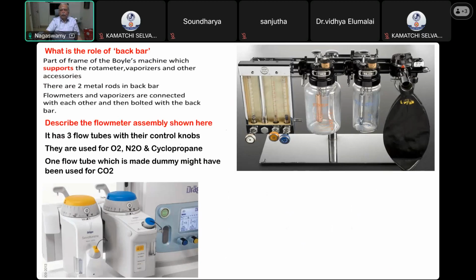That is when I turn this switch here. Are you seeing this? My pointer there. Yes, sir. Now this is in semi-open. If I turn this, I cannot lift this lever. This will not go up. So trilene is prevented from entering the closed circuit with soda lime. What is the reason? Neurotoxicity.